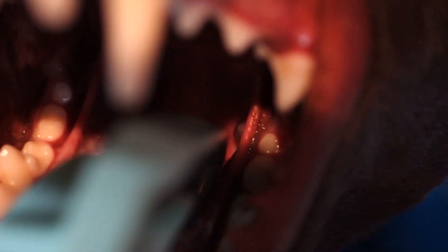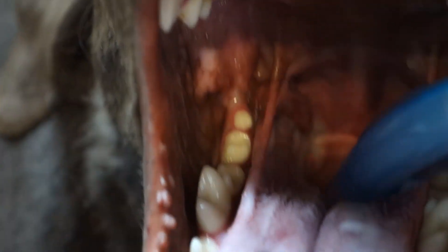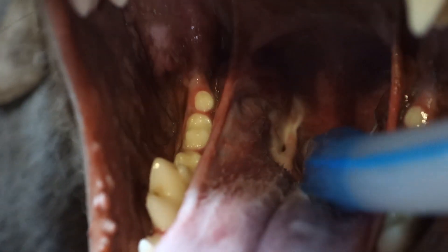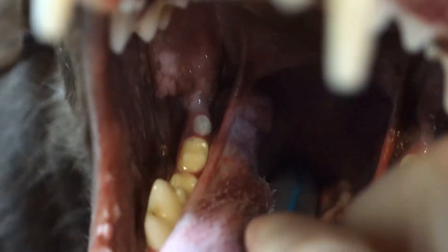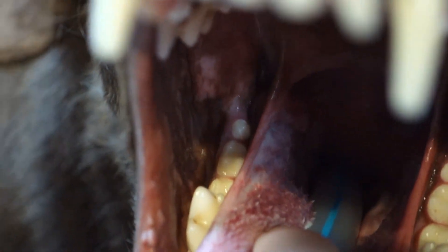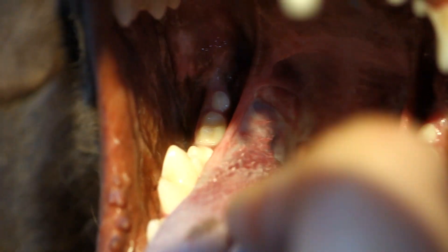I'll try again. Actually, can we do it without the laryngoscope? I'll try without the laryngoscope. There we go. So now we've got the soft palate up out of the way — push it out of the way. Epiglottis sitting there. We'll bring that down forward. And then once we've got that forward, you can see the arytenoid cartilages that house and make that little vertical slit. And that's what we're aiming for to get in. So now we have the tube in place. It's tricky — you can see that, it's a big black hole. It's just about to chew me.